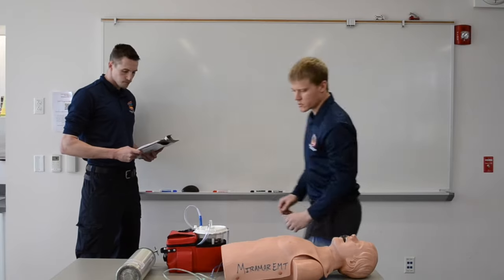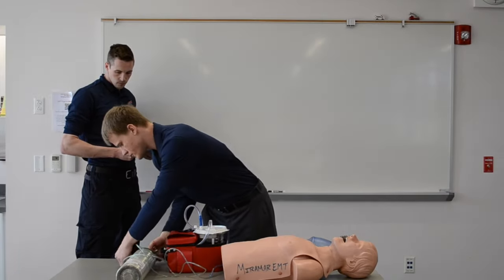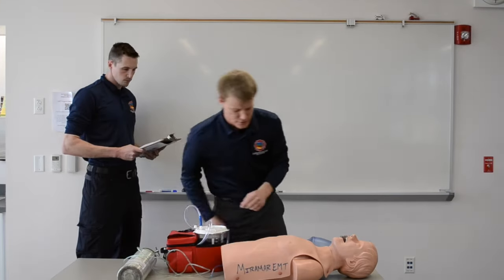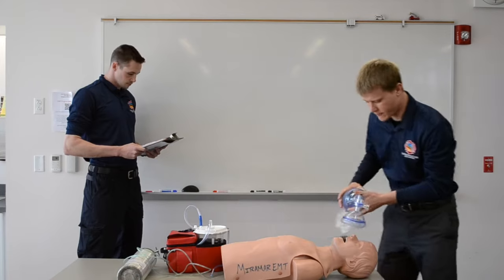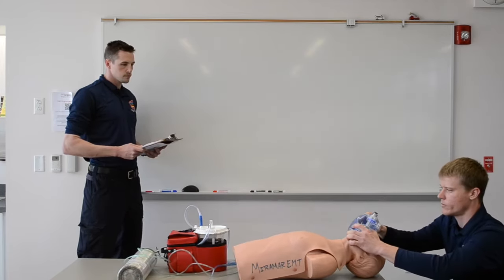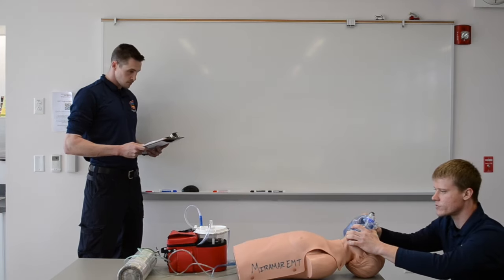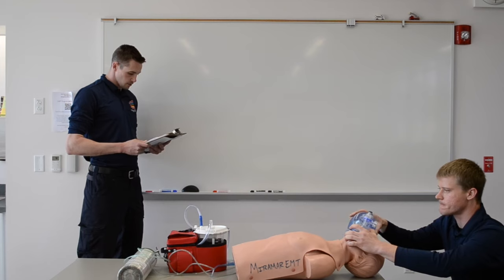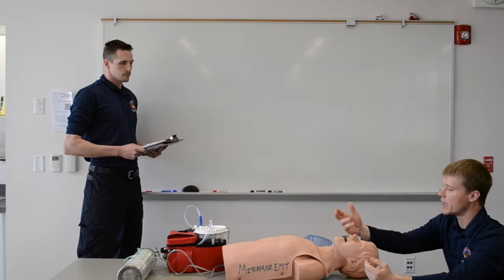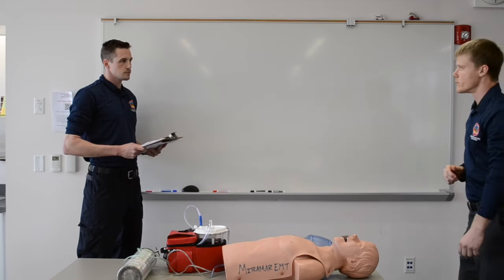Let's take our O2, plug it into the tree, turn on the tank, and turn the regulator to 15 liters a minute. Now I'm BVMing on high-flow O2 — bridge of the nose, cleft of the chin, CE grip. One-one-thousand, two-one-thousand, three-one-thousand, four-one-thousand, five-one-thousand, breath. How would you know you were delivering appropriate volumes with each ventilation? When we see bilateral chest rise and fall, and we're going for a ventilation rate of 10 to 12 a minute.